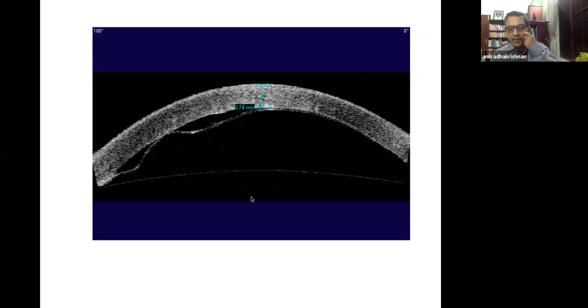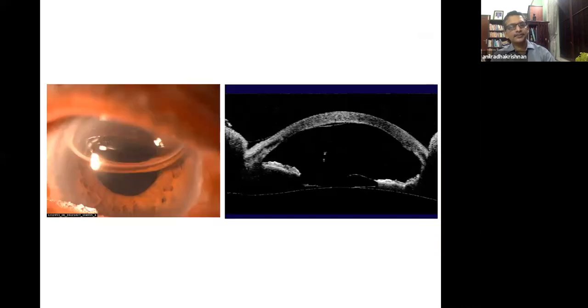There are multiple modules with which you can do the OCT. Visante Omni gives you a lot of advantage regarding the scope of imaging, like this high resolution corneal imaging. Compared to this area, where the cornea is clear, in this area it is edematous and opalescent. This is after C3F8 injection. You can see that the same patient now has a clear cornea and the DM is attached.